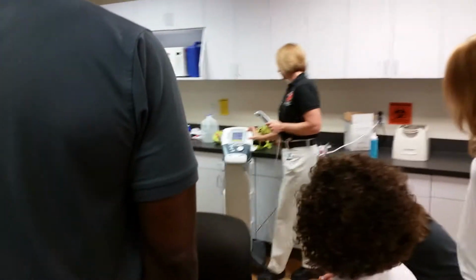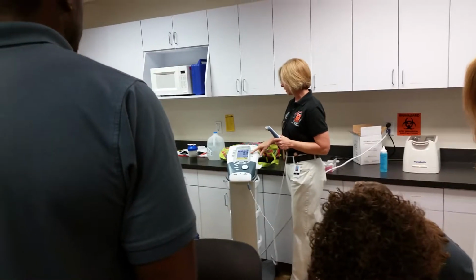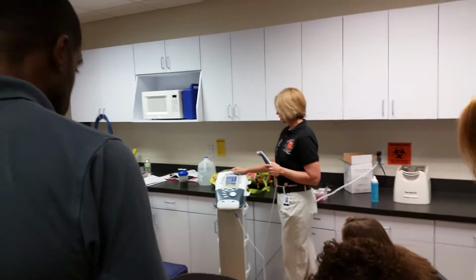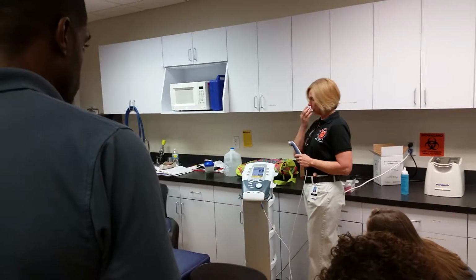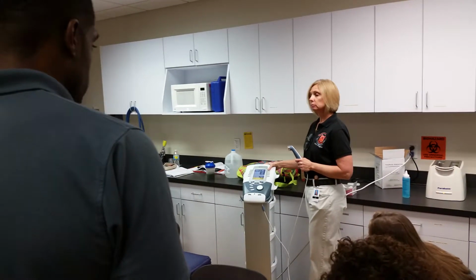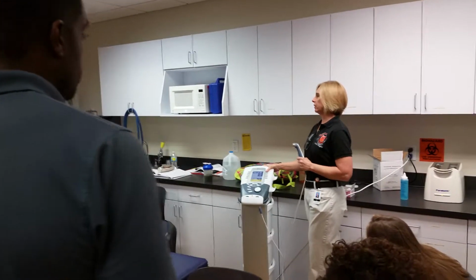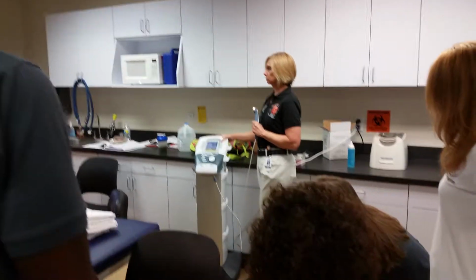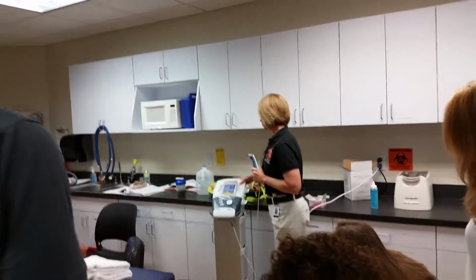And then on the right-hand side, you're going to see frequency, duty cycle, and then display and intensity in watts per centimeter squared. So 1 megahertz does what? How deep does that go? It goes deeper. Okay. So we have to look at the area that we're treating and decide, is this deep or superficial application? Okay. So we're going to do a superficial application, which means I'm going to change it.